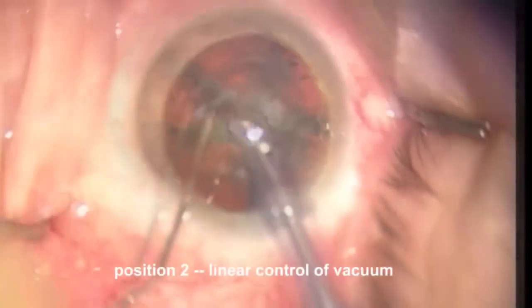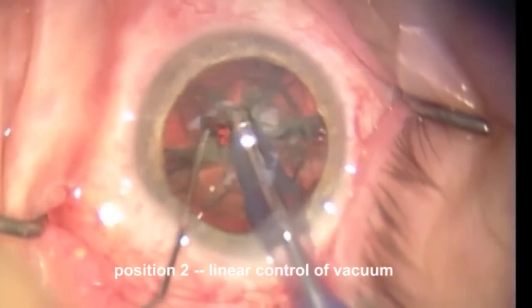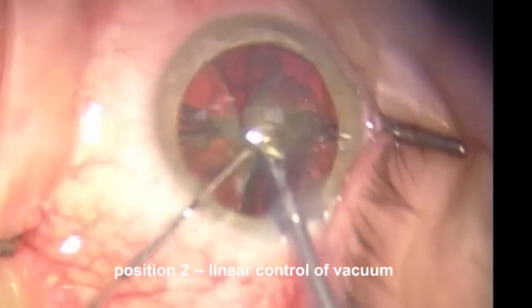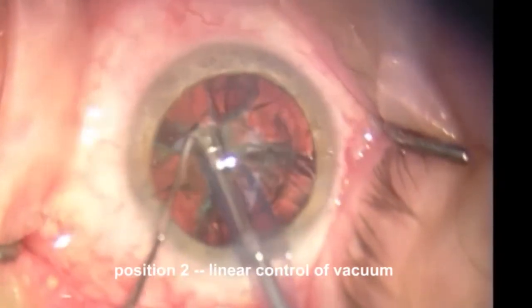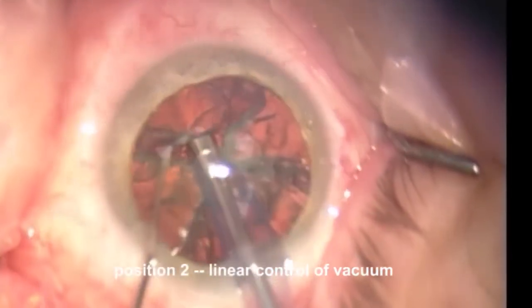We've now chopped this into several pieces. Now we're going to switch over to linear control of vacuum where we can just gently push down on the pedal just enough so that we get the piece to come towards us. We're using linear control — normally during this quad removal section I'll use a fixed vacuum, but in this case we're going to use linear control so we have very good control as we bring these pieces to the center.